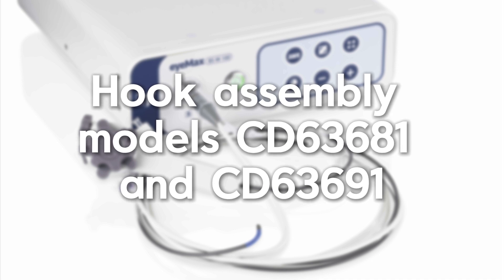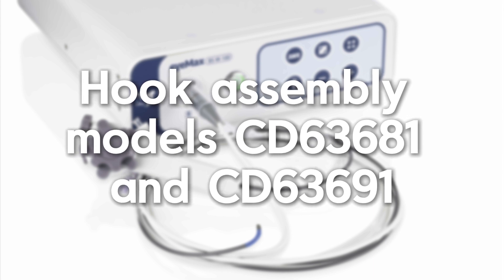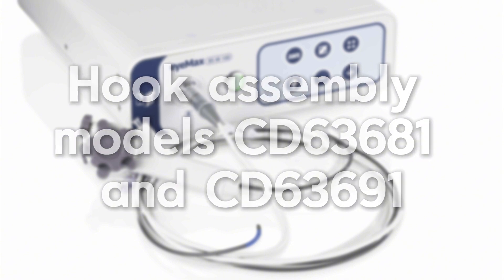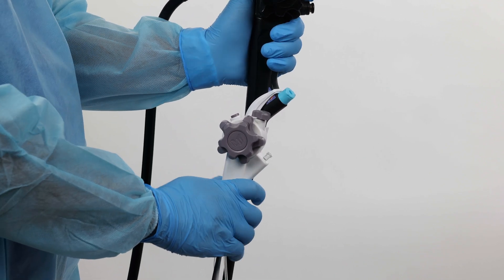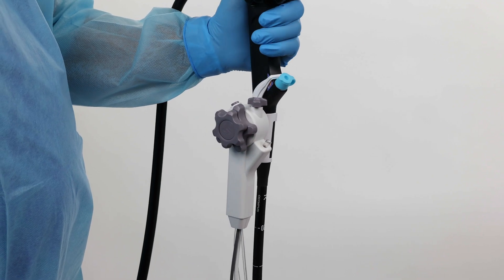When the IMAX scope is equipped with a hook assembly, such as models CD63681 and CD63691, it can be attached to the duodenoscope using the hook. Place the hook part of the handle over the biopsy port of the duodenoscope. Clip the scope onto the handle of the duodenoscope and ensure that it is secure.